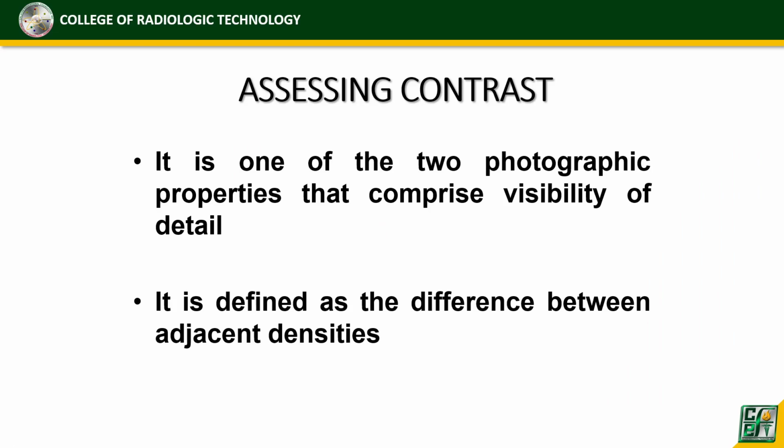When assessing, contrast is one of the two photographic properties that is important for us to be able to see the detail.